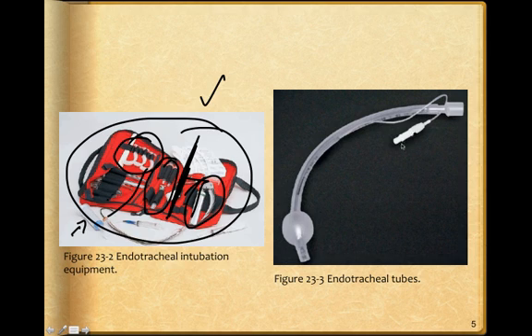Now this is an endotracheal tube. This is the top of it, and this is a universal connector that will connect to the BVM. Now, very simply, be sure that these are connected whenever you start to ventilate, or sometimes you can pull this off of there and just have the tube. So then where did this go? Is it still in the end of my bag?